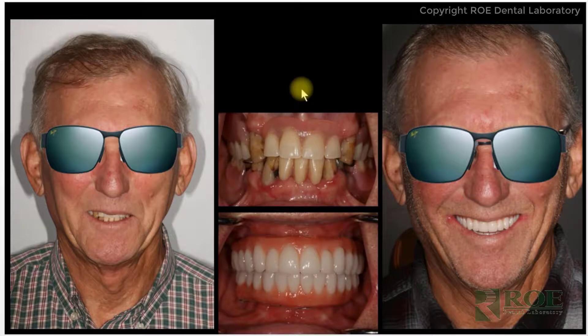We don't have all the photos from the surgery, but most of our videos involve the Chrome surgical protocol, which is a repeat every time — it's a very standard procedure. We're going to go through this case as an example of Chrome Guided Smile from very beginning smile images all the way through to the final restoration, including iJIG and printed try-in.